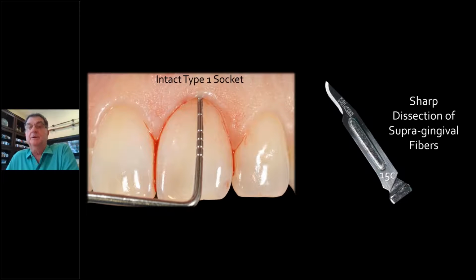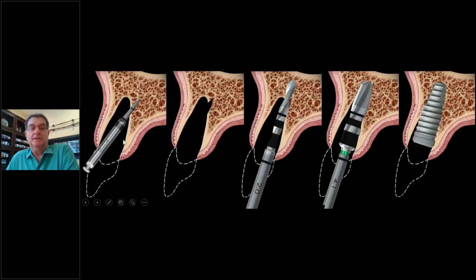And there's the big problem on the palate. Now the buccal plate is intact. Now here's the real key, and certainly Abdul showed this rather well, but I want to emphasize this. You cannot slide off that palatal wall. I love the fact that you showed it keeps sliding. You have to start with a sharp dissection burr, and that's the only burr that aims out the buccal, and it perforates about 2/3 up the palatal socket.